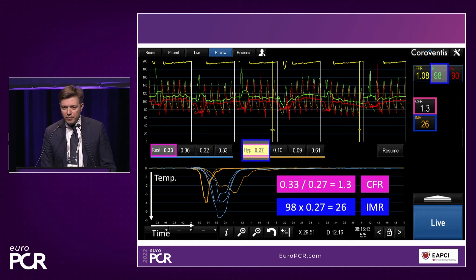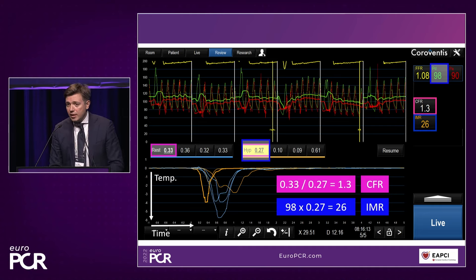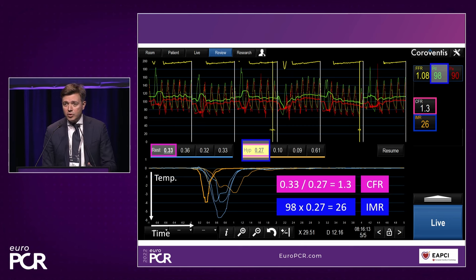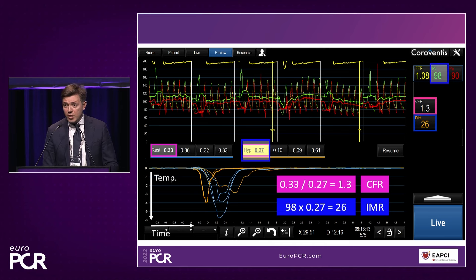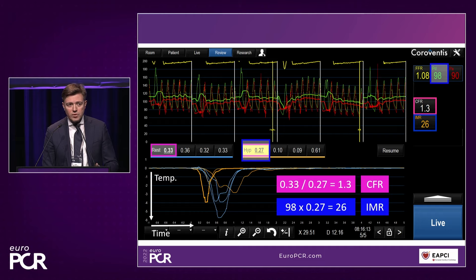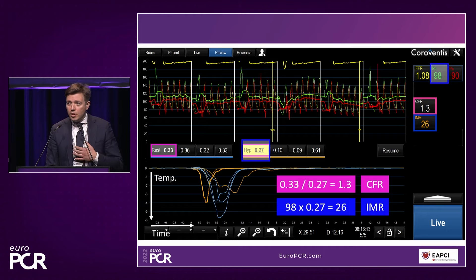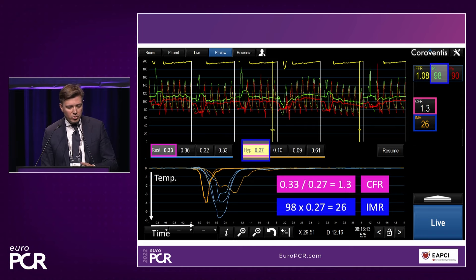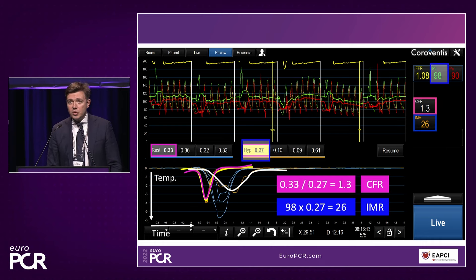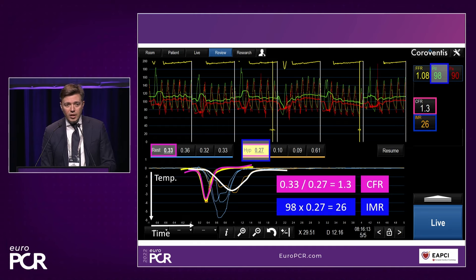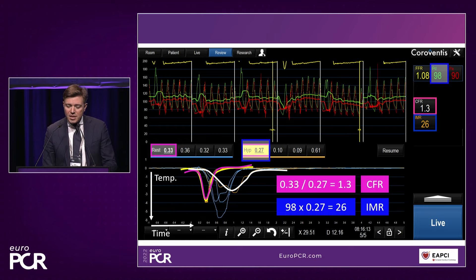Looking at the Y and X axes — temperature on Y, time on X — every saline injection produces a temperature drop followed by recovery. The resting curves in blue are fairly at the same place. But the orange hyperemic curves show variability with the third measurement, and the console indicates this with a yellow square. Can we accept these values? Additionally, looking at FFR value of 1.08 — there is pressure drift here as well. We cannot accept these values at face value and need to repeat the measurements.